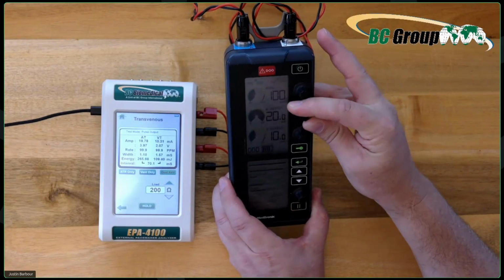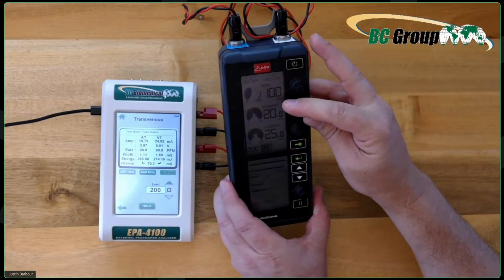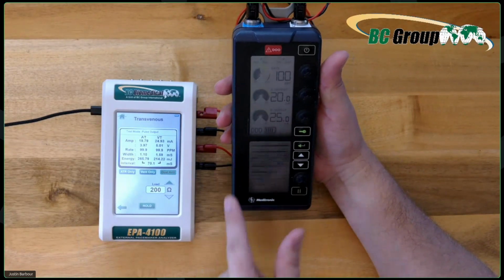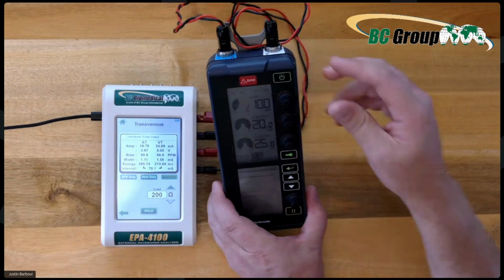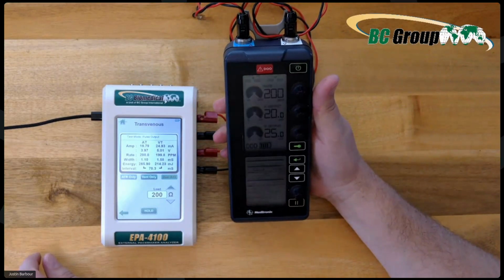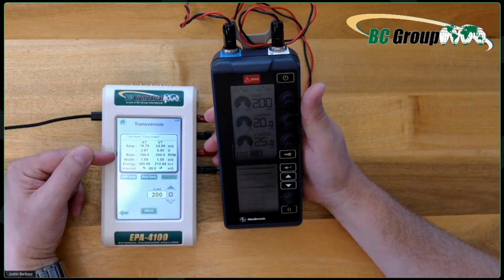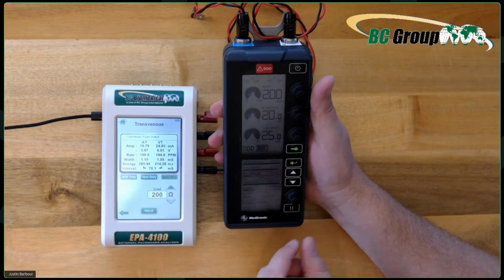Let's go ahead and turn this guy all the way up. Let's give it the full Monty. We got 20 milliamps on atria. We have 25 milliamps on ventricle. And you can see how fast the timing is on the EPA-4100. It is pretty quick. It goes all the way up to the max. And let's turn the pulse all the way up as well. You see right here, the pulse rate at 200 ppm. I'm coming in at almost exactly 200 ppm. And mind you, at 70 milliseconds, that's really tight timing.